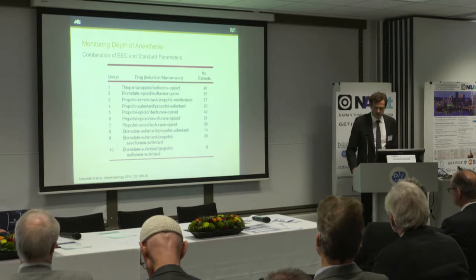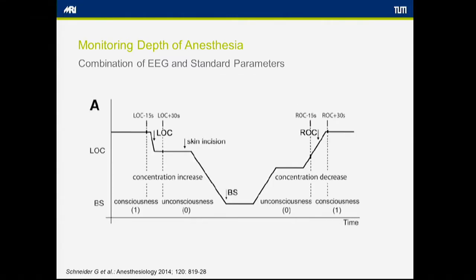There's a wide range of anesthetics which were used, and we had this clinical pathway through anesthesia, induced after a period of awake signal. We induced loss of consciousness, then we maintained anesthesia until skin incision, and then we increased the level of anesthetic concentrations until burst suppression occurred in the EEG.